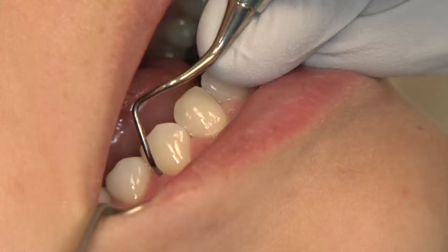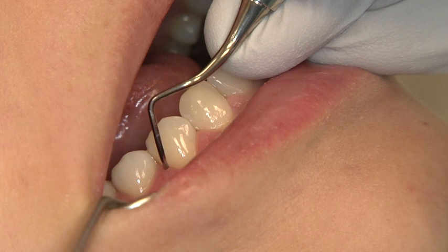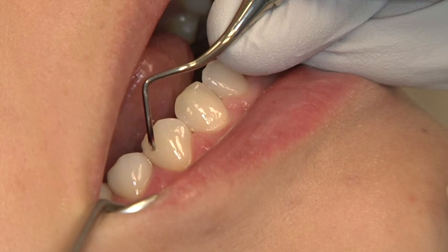Establish a correct working angulation of 70 to 80 degrees by adapting the handle so that the lower shank of the Gracey 1718 is parallel to the long axis of the tooth, with the lower third of the blade adapted against the tooth surface. Activate the working stroke using a wrist or forearm motion while avoiding flexing of the fingers.